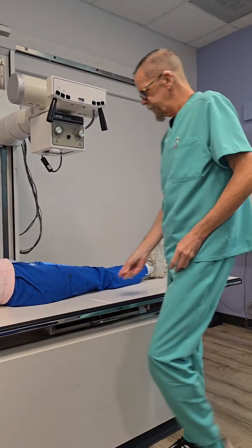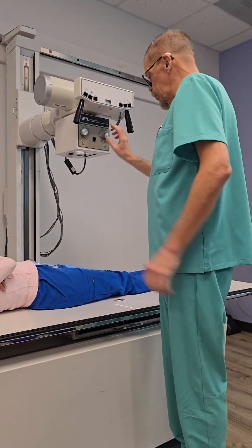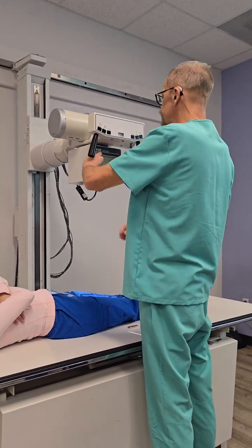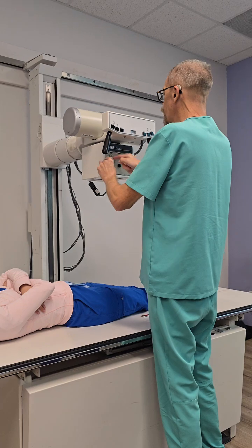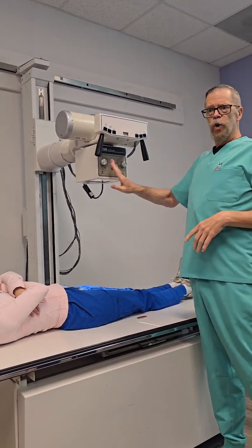Let's send two markers down there. Alright, so we're going to start with the proximal. We want our 40-inch collimation open at 17 — no more than 17.